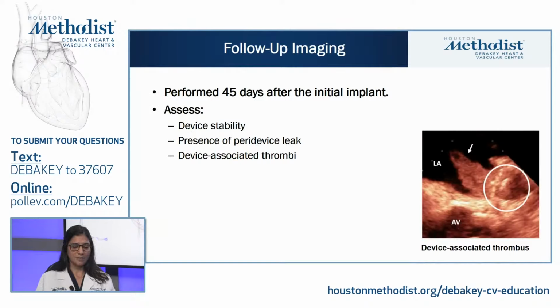Follow-up imaging is performed 45 days after the initial implant, and the role of follow-up imaging is to establish device stability, the presence of a peri-device leak, and look for any device-associated thrombi, like the case right here, because the patients will be on anticoagulation for 45 days after the implant. And if you don't have any leaks and there are no thrombi, then you can take the patients off anticoagulation and switch them to antiplatelets.